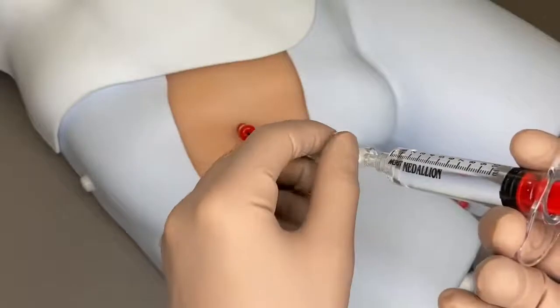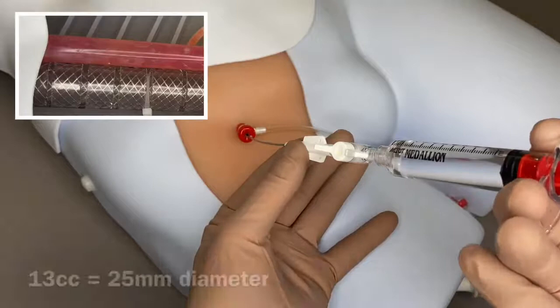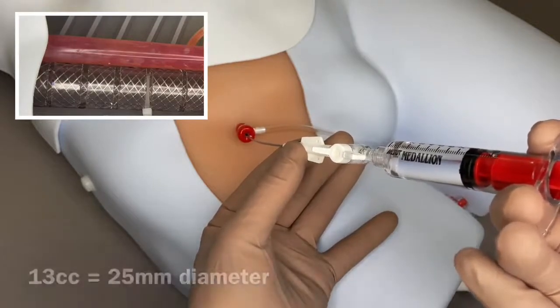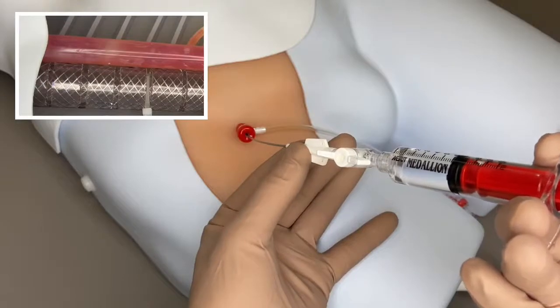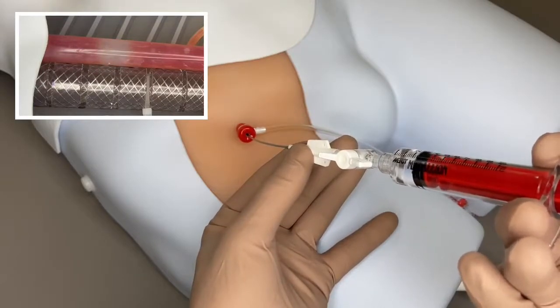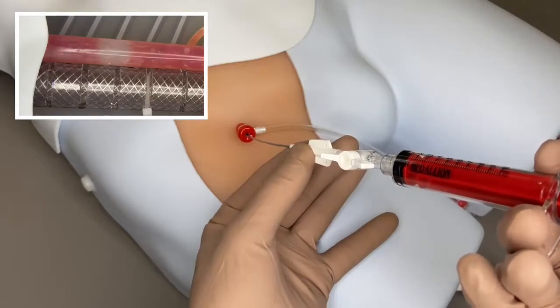To inflate the balloon, open the stopcock and slowly inflate the balloon until vessel occlusion occurs. Do not exceed the maximum inflation volume of 13 cc, and refer to the IFU for occlusion confirmation techniques. Note that you may have to refill the syringe to enable full vessel occlusion.